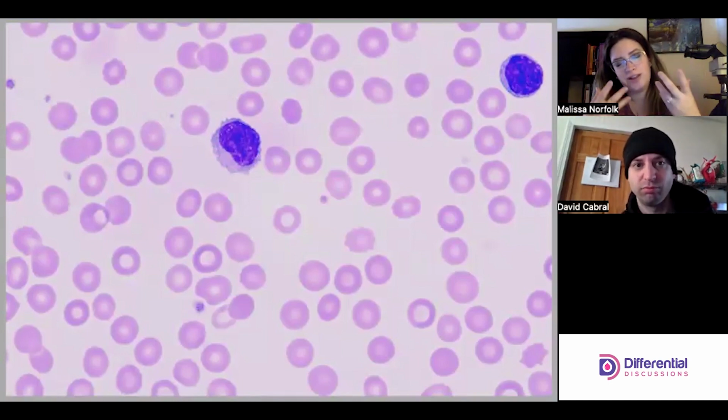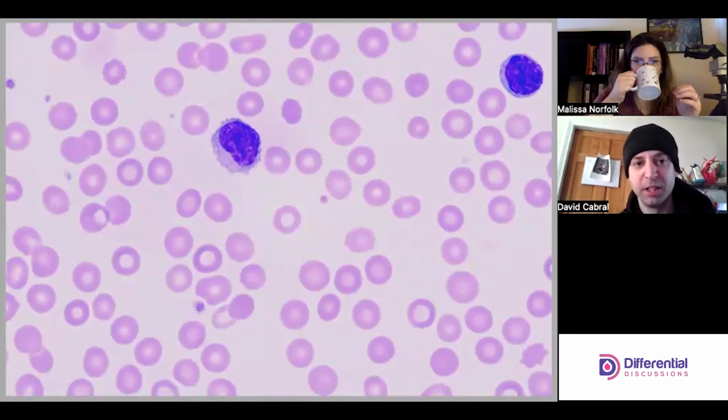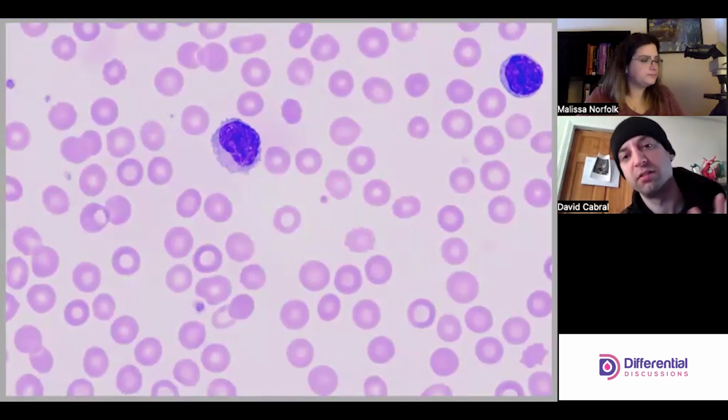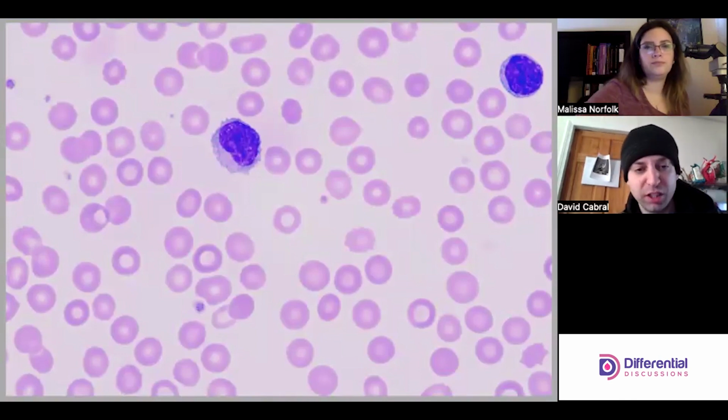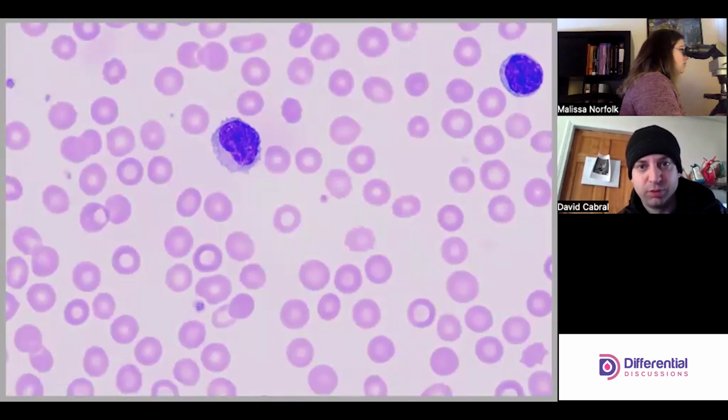You expect to find that in the acutes and not the chronics. That's why we don't see that here. And I've seen acute leukemias that have an okay H&H, right? There's a fair amount of red cells. But platelets are just such a sensitive indicator, right? Once an acute leukemia has taken a foothold, platelets just fall off a cliff and disappear. So when you first look and you see platelets, it's not as much of an emergency necessarily, right? And so that colors how you interpret things.